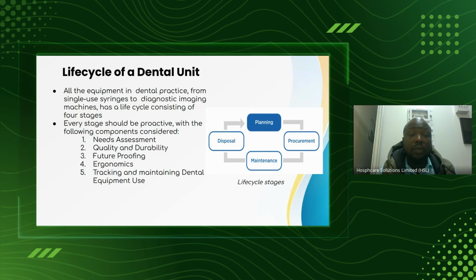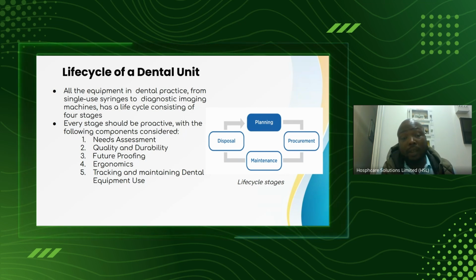And then you need to have a compressor design, where your compressor will be. If it is an industrial compressor, which makes a lot of noise, you need to put it far and do the pipe work. If it's a silent one, oil-free, you can design it near the clinic. Use the time of the planning.